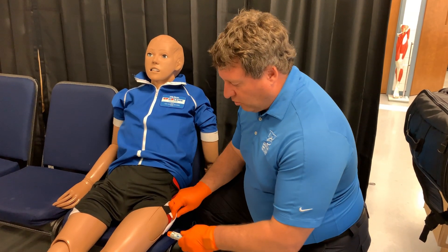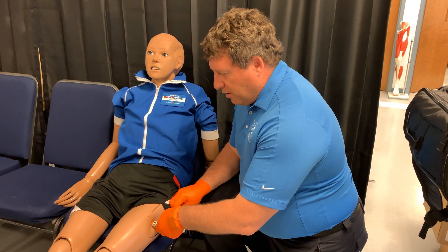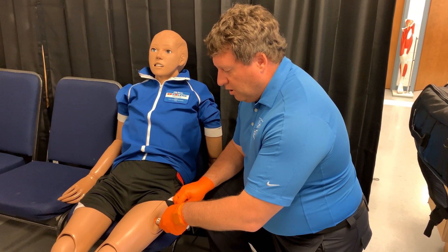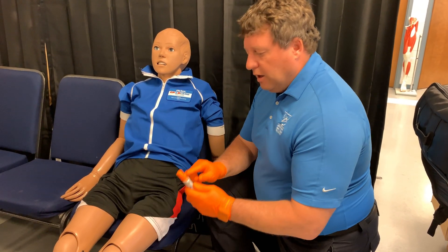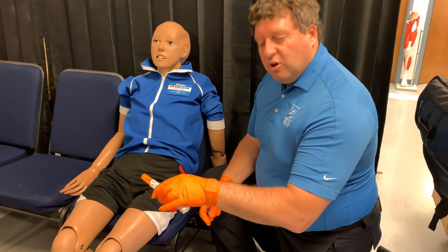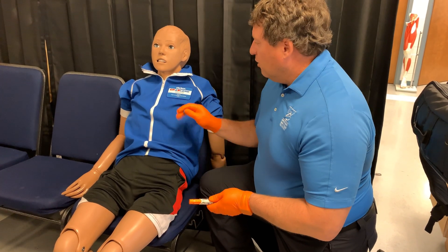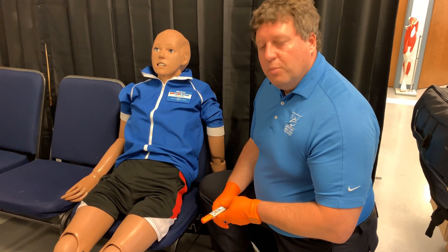I can go through the clothing, but in this case he has shorts so I'll just lift it up. Press until I hear a click, hold it there for about three to five seconds, then pull it out. This part is now hopefully covering the needle, but I still want to put this in a sharps container. I note the time I administered the epinephrine and keep reassessing my patient.